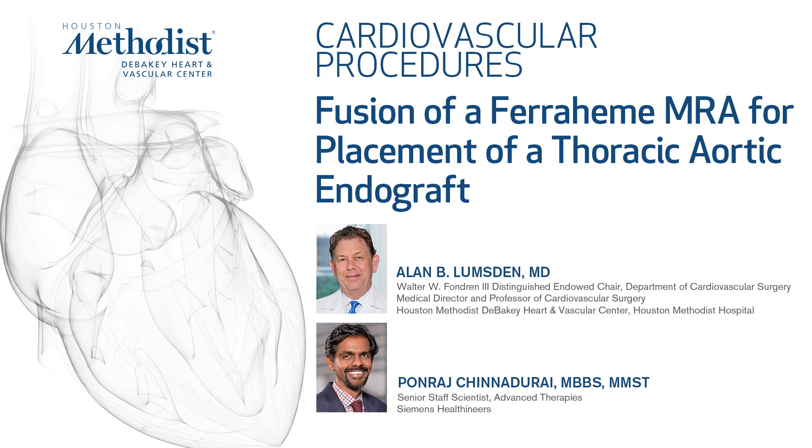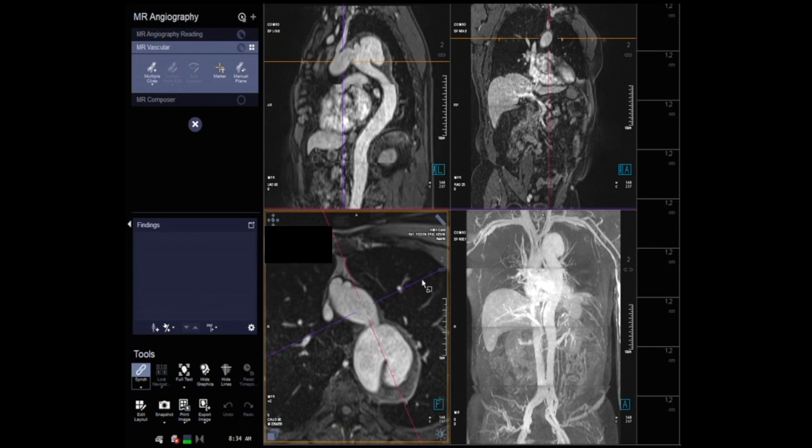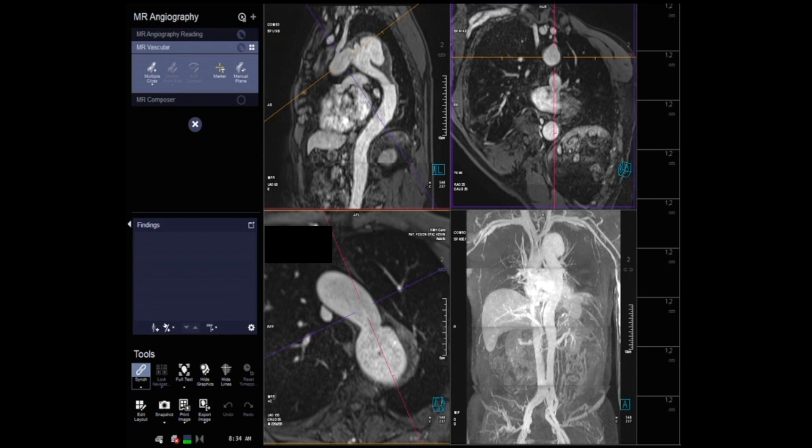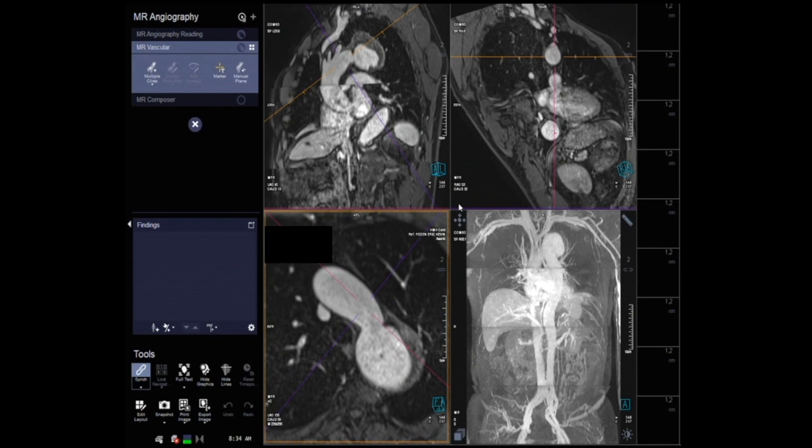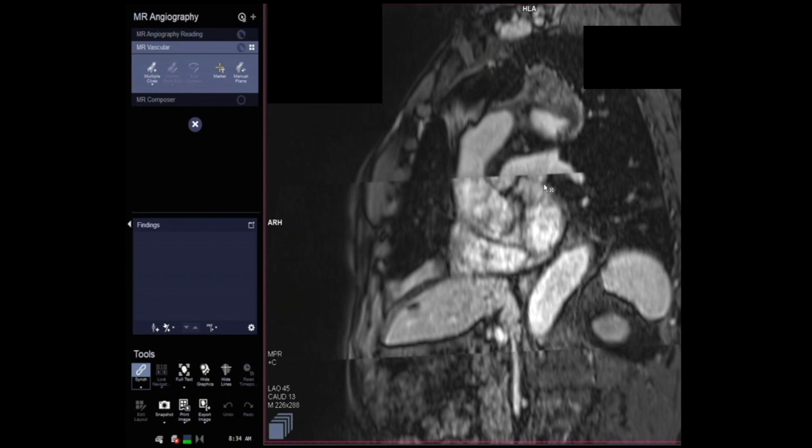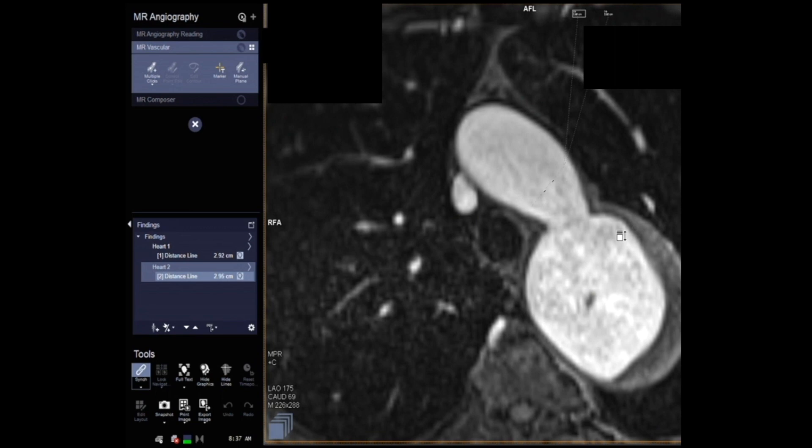In this video, we're going to demonstrate the use of MRA fusion as a guidance system for the TEVAR stent graft. Here we can see a ferumoxytol MRA which has been performed, which can be manipulated in exactly the same way as a CT scan and multi-planar reconstruction. We use ferumoxytol when a patient has an elevated creatinine, cannot be given standard contrast agents and cannot be given gadolinium. And here you can see how we can optimize in exactly the same way in a workstation to get the ideal angles for implantation.